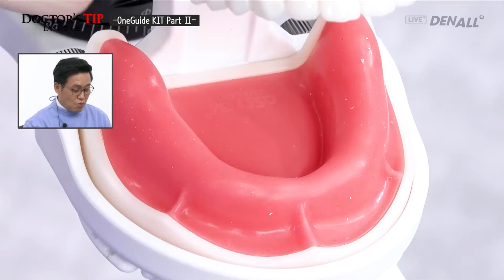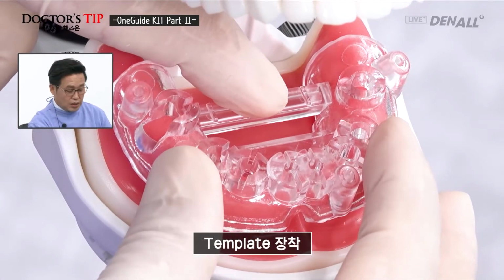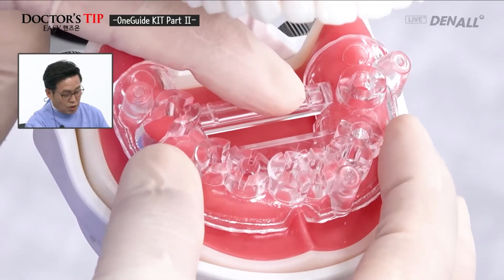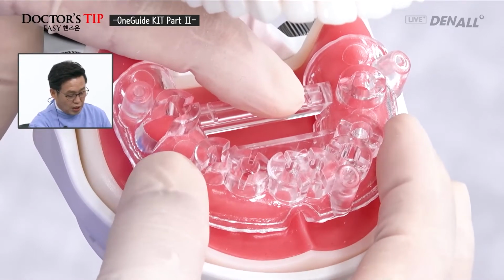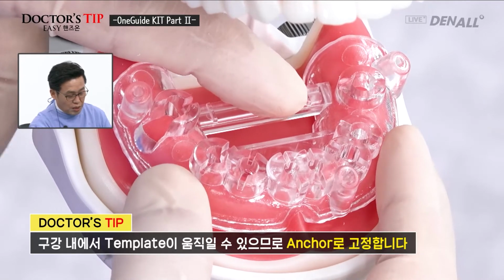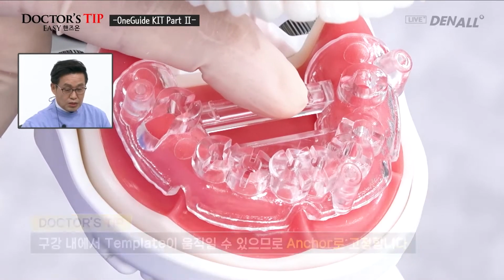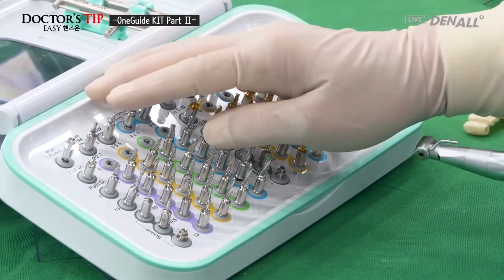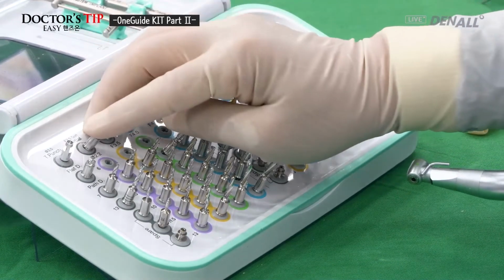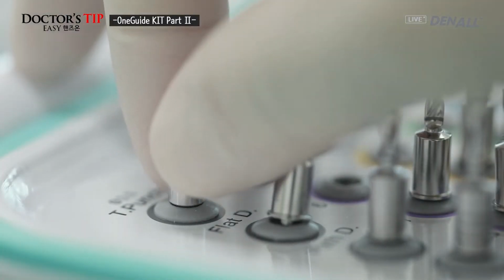First, surgical template is now mounted on the fully edentulous model. After you mount it, check whether it's moving, and the soft tissue, although this is a model, the soft tissue can move, so I'm going to use anchor. Using tissue punch, I'm going to remove the tissue, and the diameter 3.5 regular hole tissue punch is going to be used.